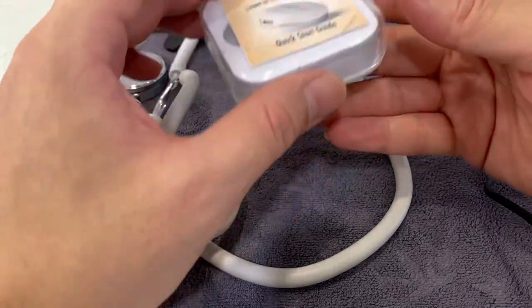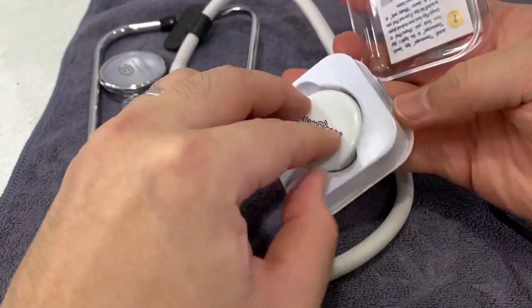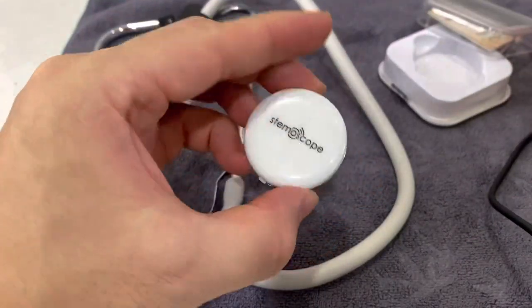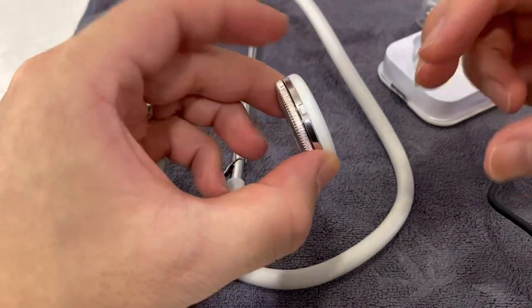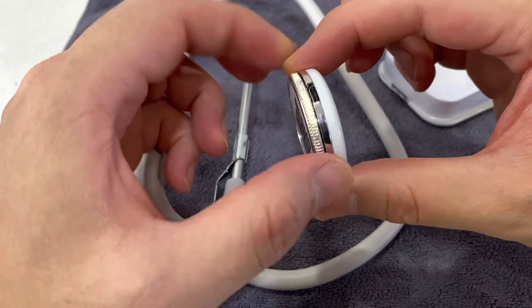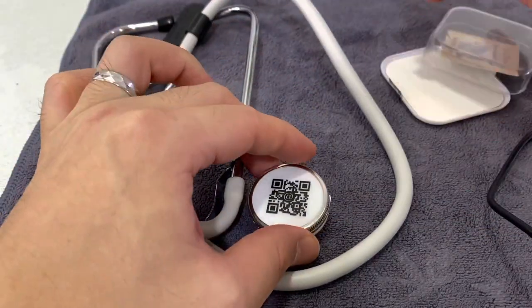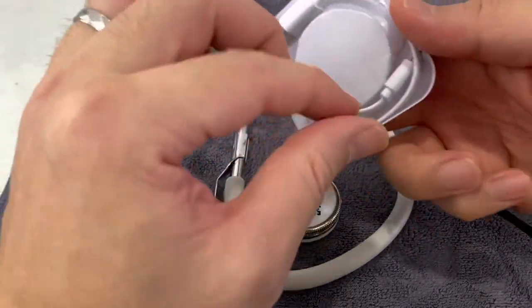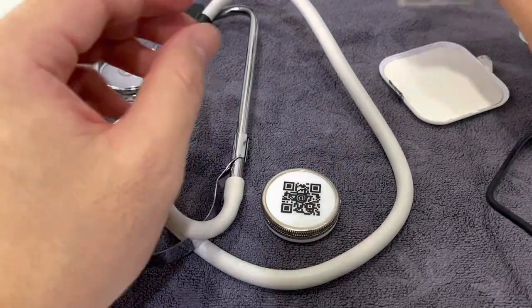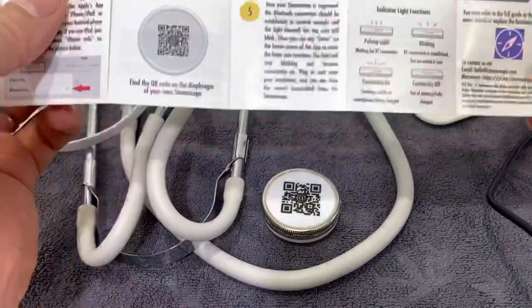So this is the unboxing. Very simple, very small box, very small device. That's the membrane side, this is the hard shell side. Just going around the device itself - there's a switch and there's the charging port. It's a USB charge connection.